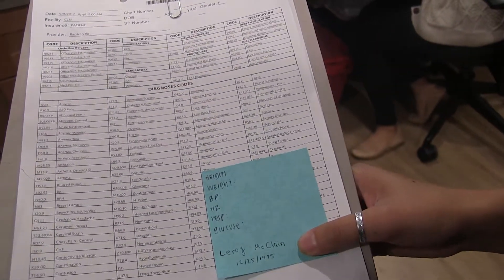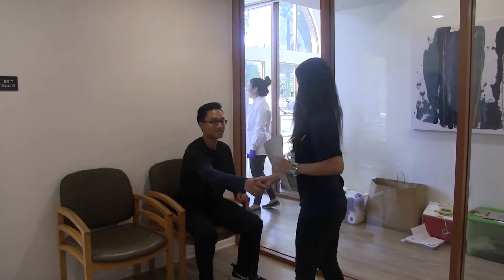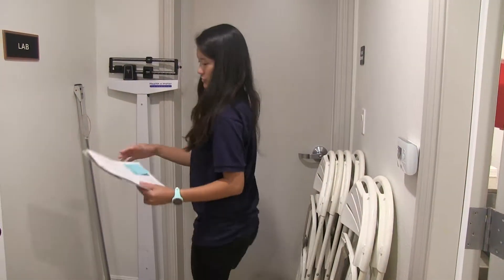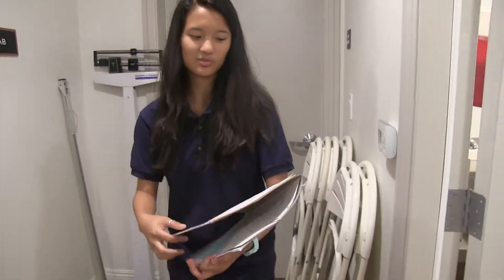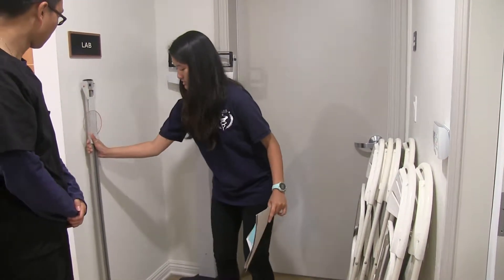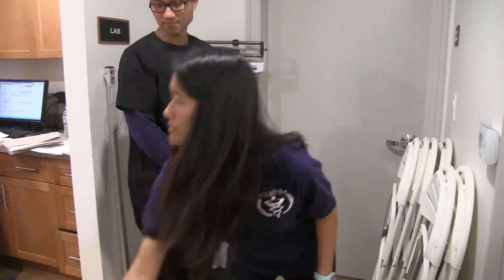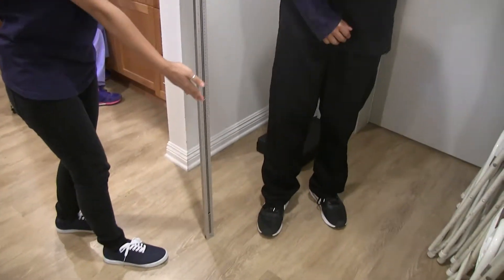We're going to call the patient from the waiting room. After you introduce yourself to the patient, you can bring them to the back to take vitals. For this patient in particular, he already has his height taken. Normally if it's a new patient, we take their height again, but if it's an existing patient, we don't have to. Just for practice, I'll show you how to do it. Here's the ruler we use — make sure the ruler is flat on the floor and make sure he's standing on the floor and not the scale.